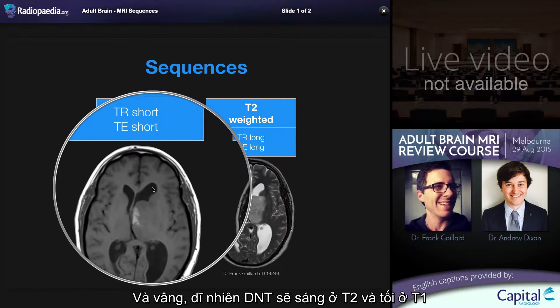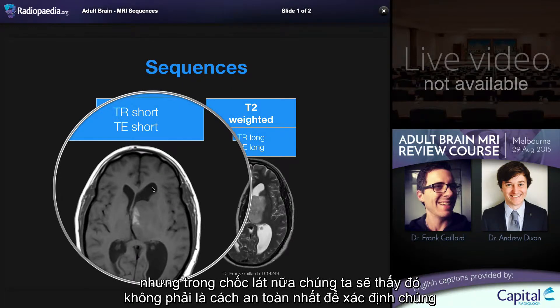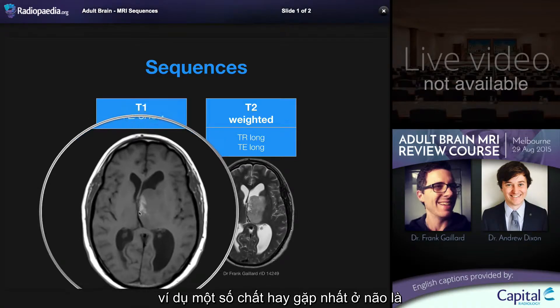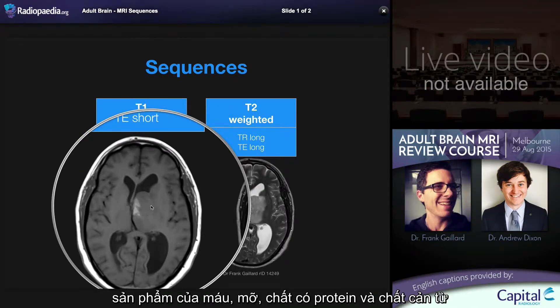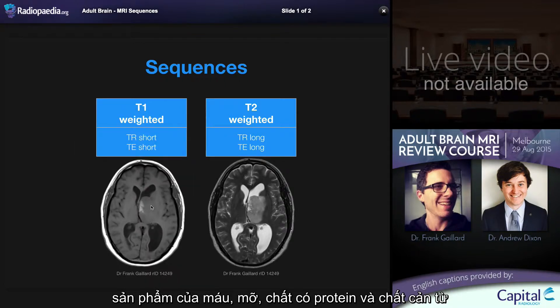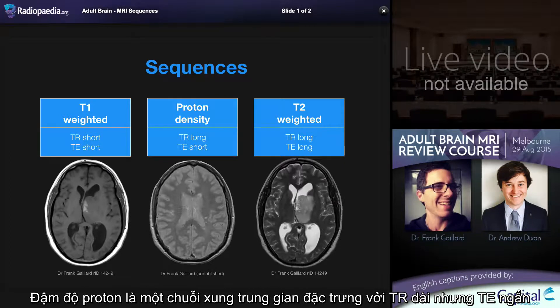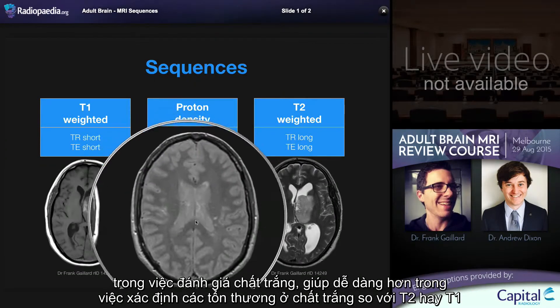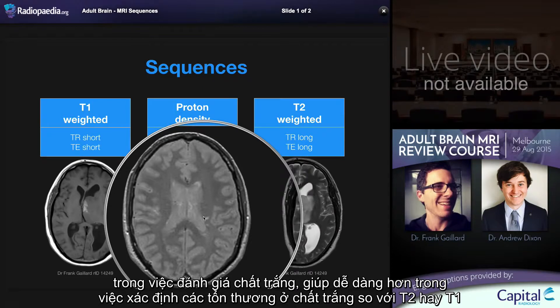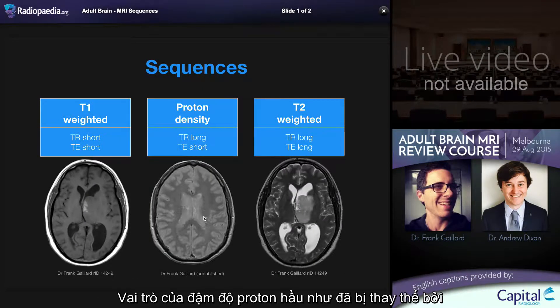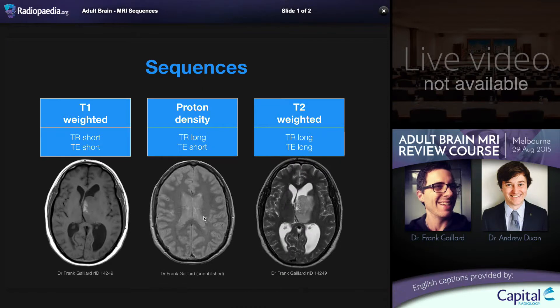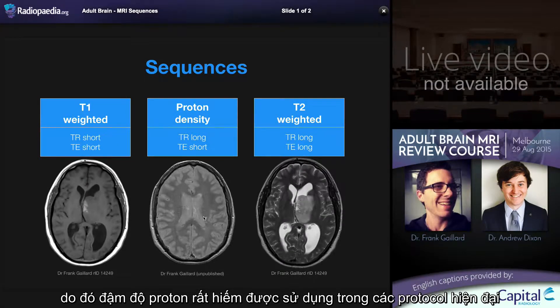The CSF is bright on T2 and dark on T1, but as we'll see shortly, that's not always the safest way of identifying them. A number of substances are hyperintense on T1, with the ones most relevant to the brain being blood product, fat, some proteinaceous material, and contrast enhancement. Proton density is an intermediate sequence characterized by a long TR but a short TE, and has appearances that were very useful in the early era of MRI in examining white matter, making white matter lesions easier to identify than on T2 or T1. The role of proton density has largely been superseded by FLAIR imaging, or fluid attenuated inversion recovery.